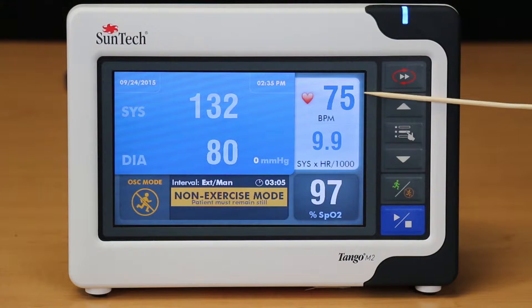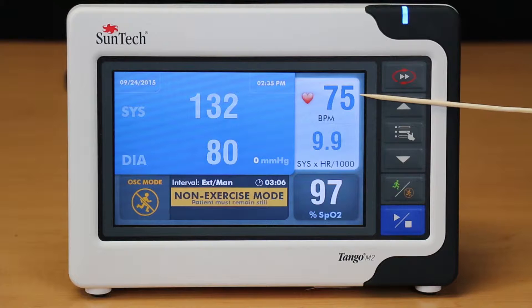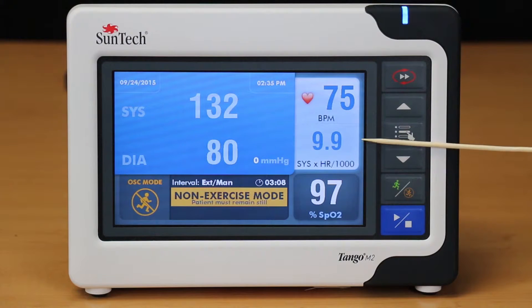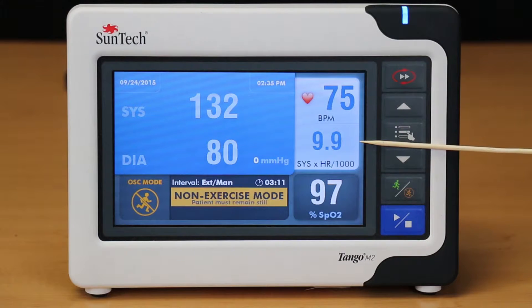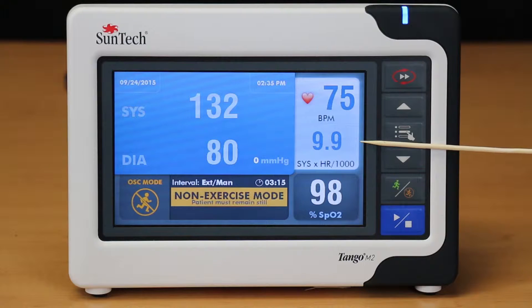The heart rate measurement is displayed in the upper right corner of the screen. Directly below the heart rate measurement, you will see the double product, also known as the pressure rate product. This value is an indication of the workload being placed on the heart.